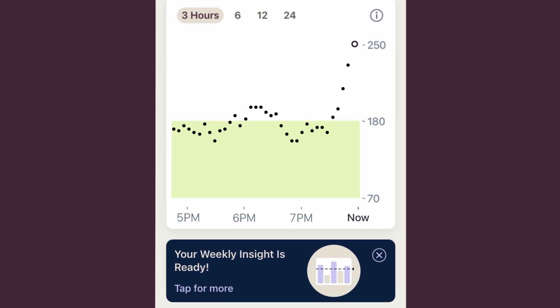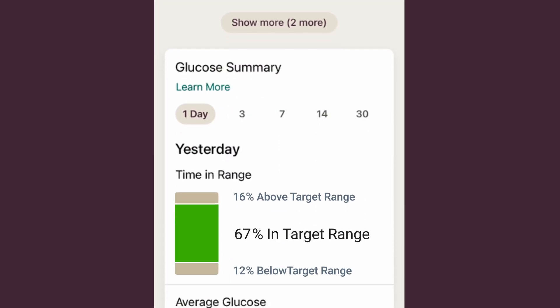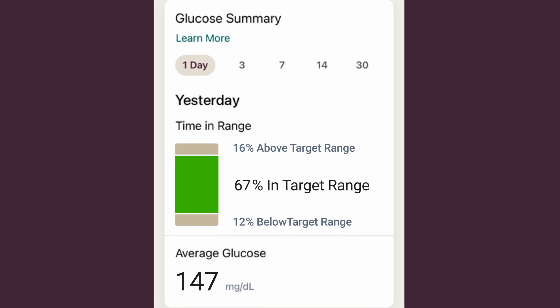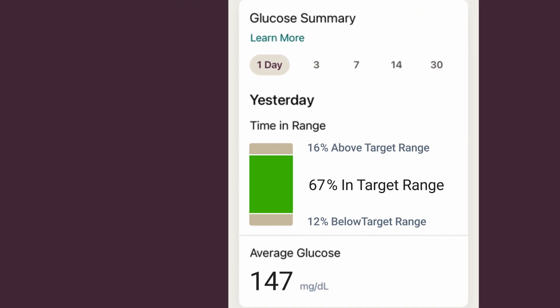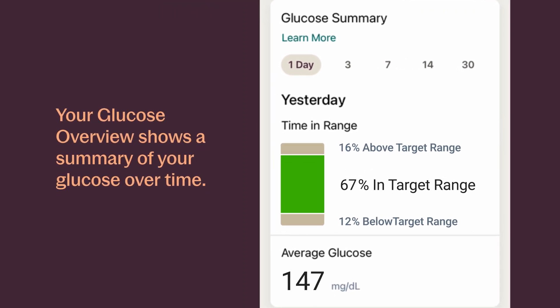You can adjust things so your graph shows you either the past 3, 6, 12, or 24 hours. If you scroll down on your home screen, you'll see your glucose summary. This shows your glucose summary over the period of time you choose.